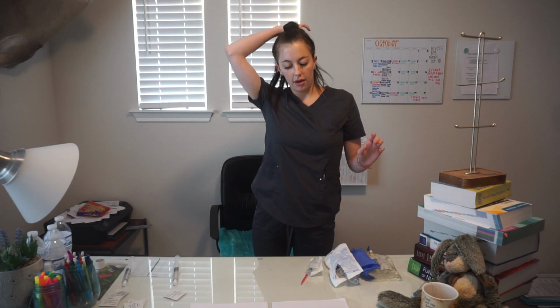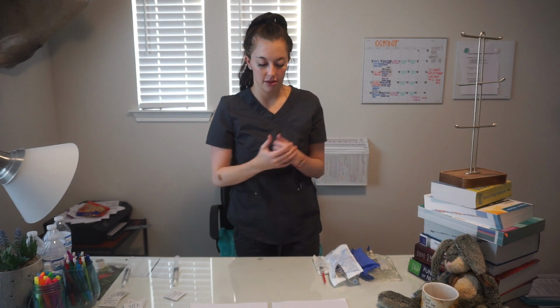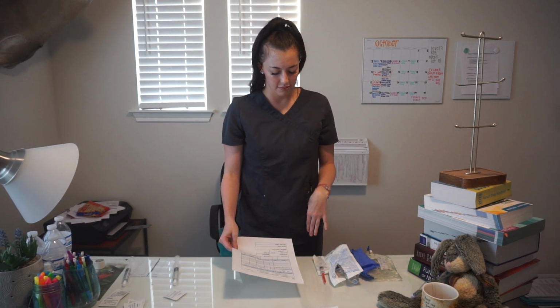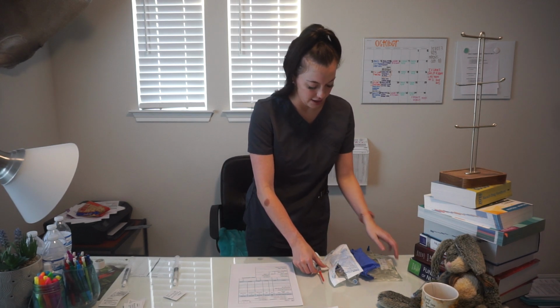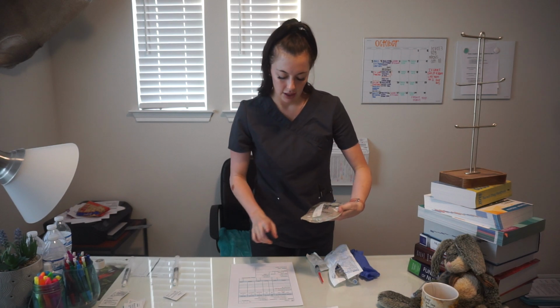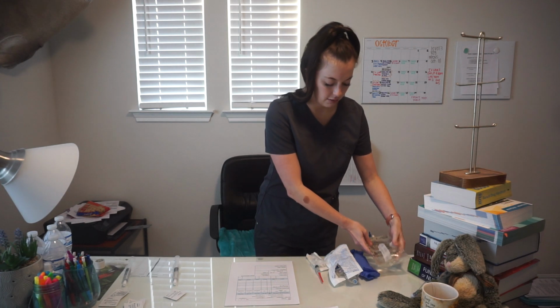Okay, I am ready to enter the patient's room. I've gathered all of my supplies, I verified my doctor's orders, and I'm ready to go. Or actually first I'm going to double check everything to my MAR. I have my D5 half normal saline, which I will put the label on when I get in the room, 100 mLs per hour.